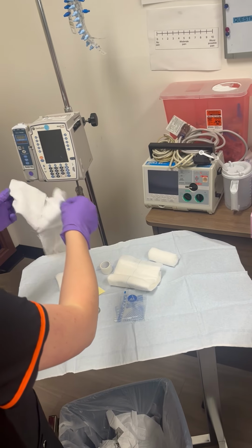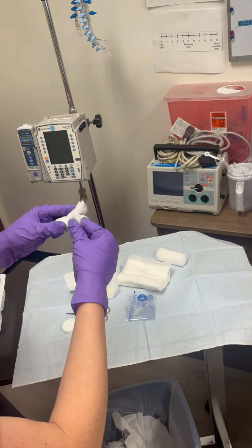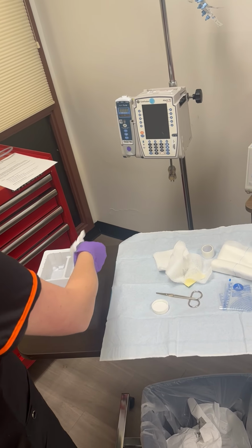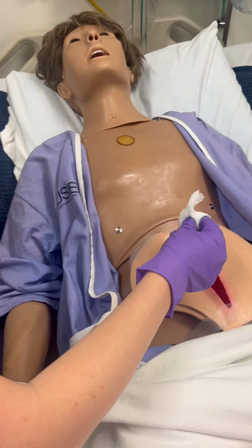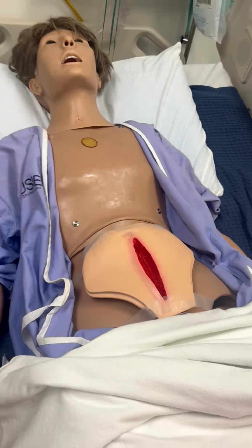So I'm gonna grab some sterile gauze. I'm going to wrap it around my finger. I'm going to dip it. And I'm gonna start by cleaning down the middle. Just nice and gently, and in the bag we go.